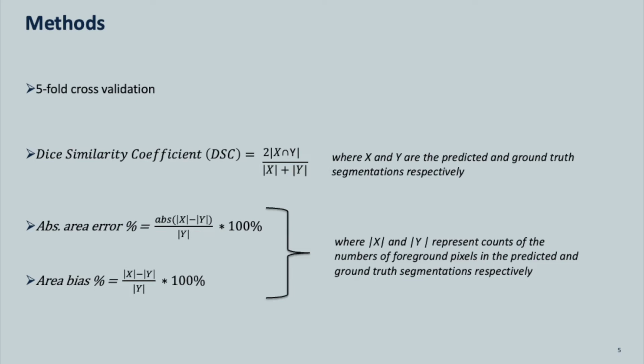Due to the large variation in appearance between images acquired from the same patients, we performed the cross-validation splits at the image level rather than the patient level. And because nnU-Net performs hyperparameter optimization using heuristic rules and not using the validation data, and because we used the model from the last epoch rather than using the validation data for model selection, these cross-validation results can be considered as independent test results.